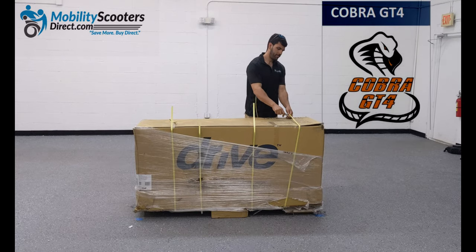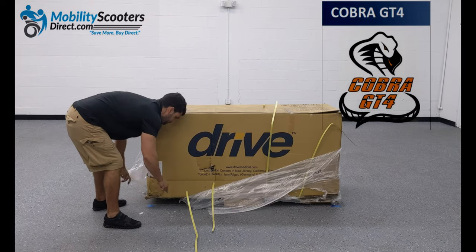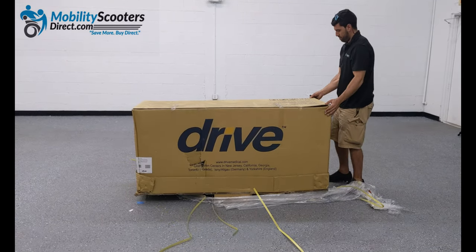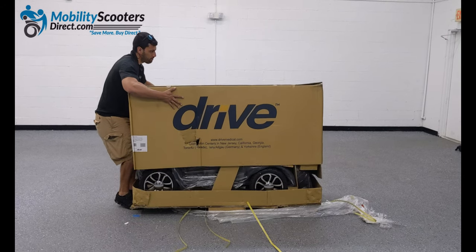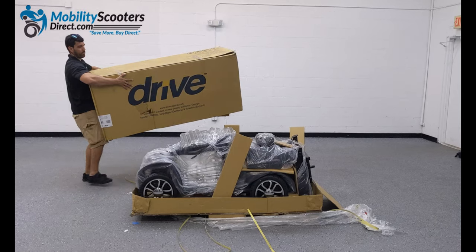The Cobra GT4 comes on a pallet. You'll simply need to cut the pallet straps and the clear wrap that's wrapped around the box. The pallet straps are used to attach the box securely to the pallet. Once cut, you can remove the top part of the box by simply lifting straight up. It helps to have a second person, but you can get it done with one person as shown in this video.